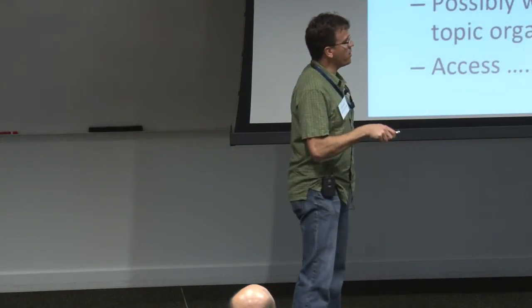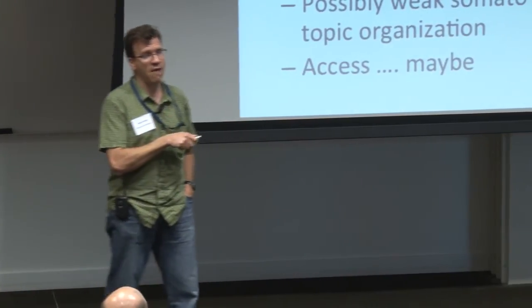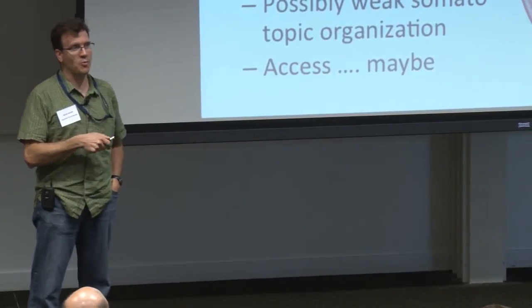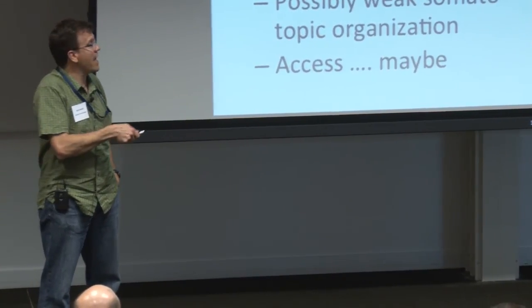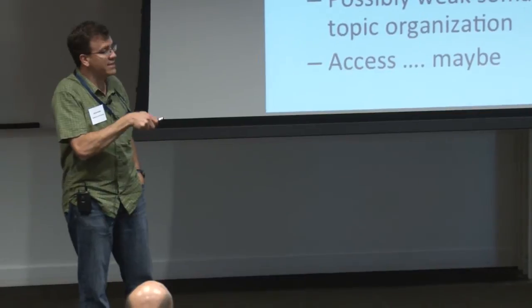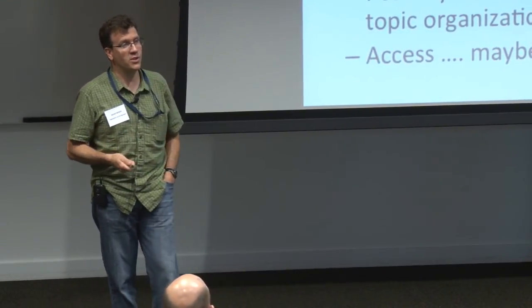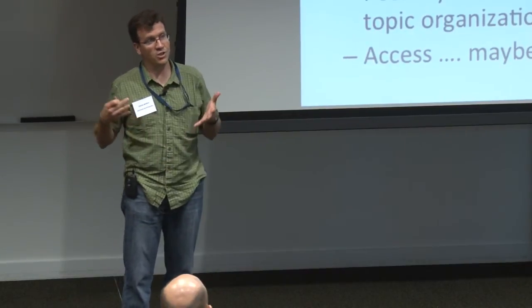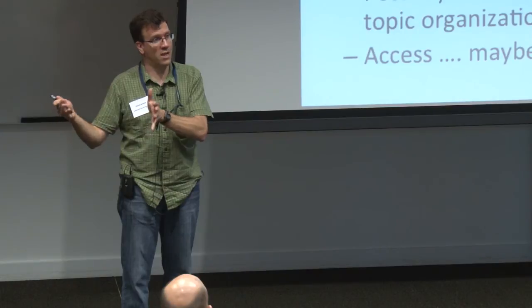And to be clear, the approach that we're taking by targeting these primary afferents won't work for those people with spinal cord injury that don't have sensation. We're relying on intact ascending pathways. Our goal is to do this for amputees, and Jan is being used in a study that's ultimately geared towards helping amputees.